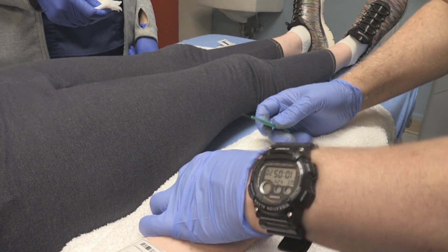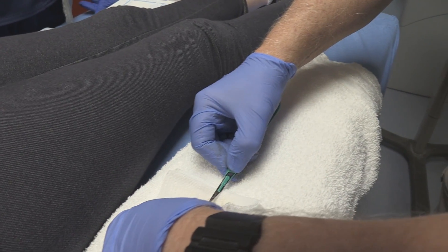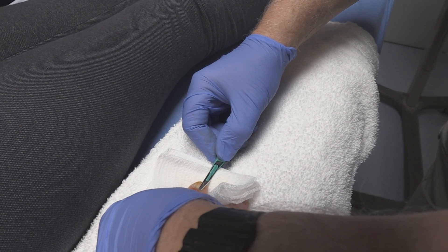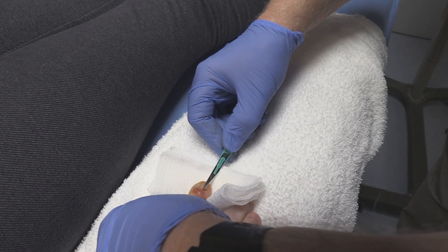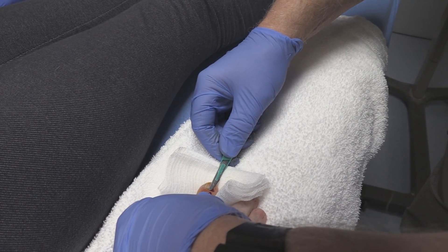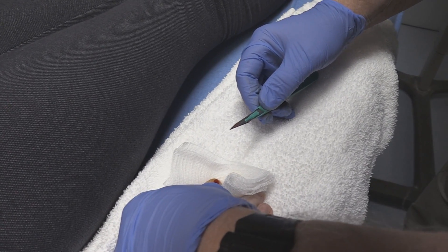So what we're going to do here is we're just going to raise this up just a little bit, and we're just going to go flat with the blade and slide right up there. Let's see if we can get any pus. I can see where the previous 18-gauge needle was. So we're just getting blood on this — no pus.